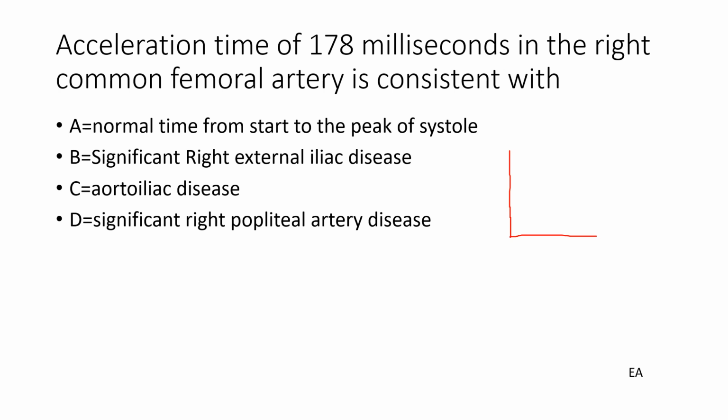So acceleration time here. For example, if we have a normal, very quick speed to the peak, and then like this, what is the acceleration time from here to this point? This part is acceleration time. Okay. In this question, we have y and x.